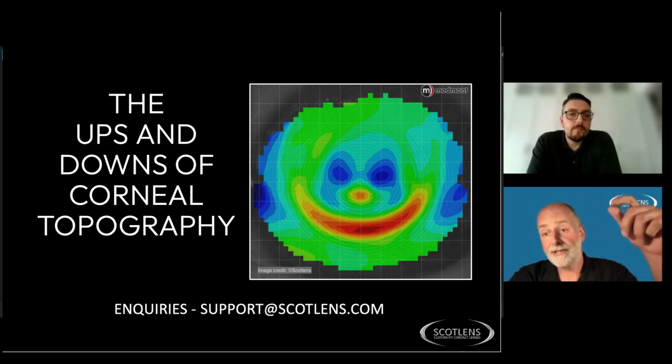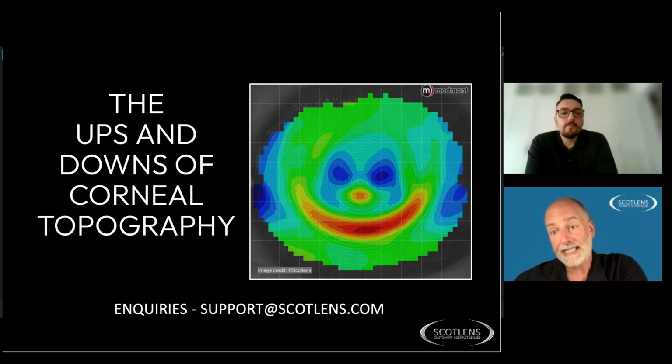Ulcers tend to nibble away the stromal tissue, so if you've had a scar from an infection, there tends to be less corneal matter there, whereas a scar from a laceration can leave a raised corneal surface. So it can depend a little on the cause as to what you're expecting to fit.